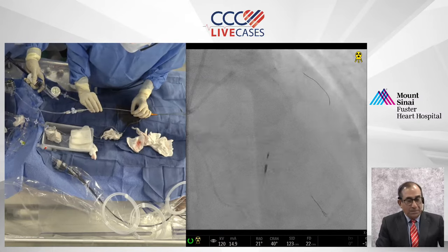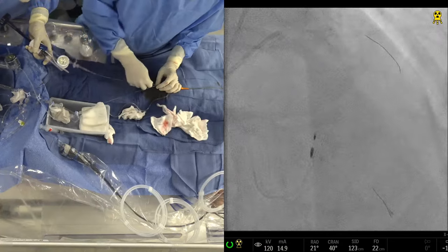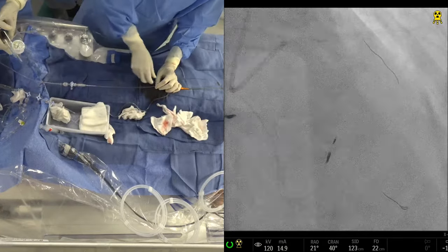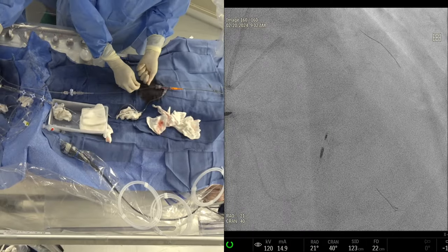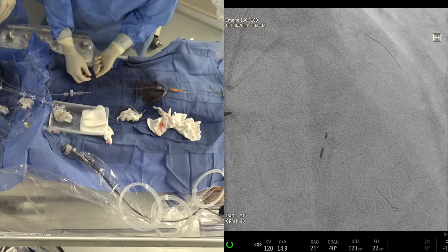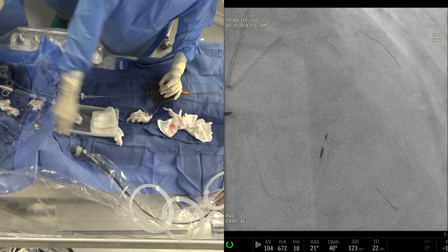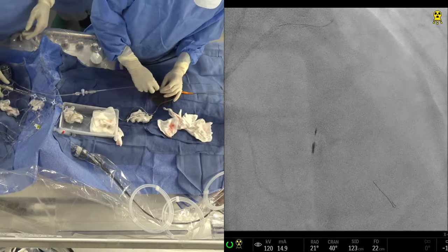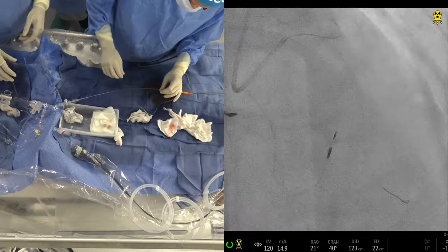Remember, you could not have put a three stent simultaneously. Right now we have done D1, D2, the dilatation. The question always comes up, it's a modified ping pong, you can call it. First we put a D2, then we put a D1. With the limited 7 French, we have done the kissing balloon dilatation, and now we are ready to go to the D2.